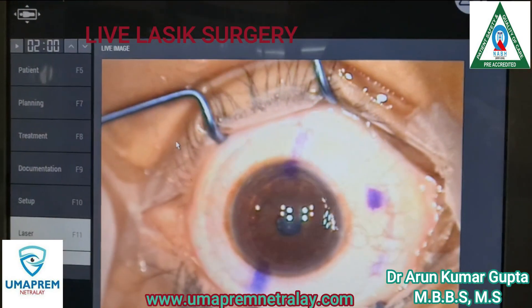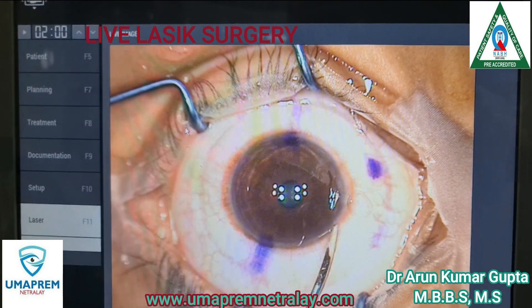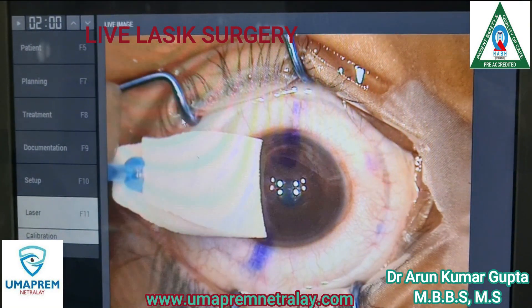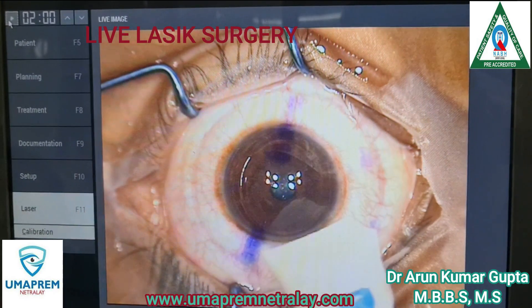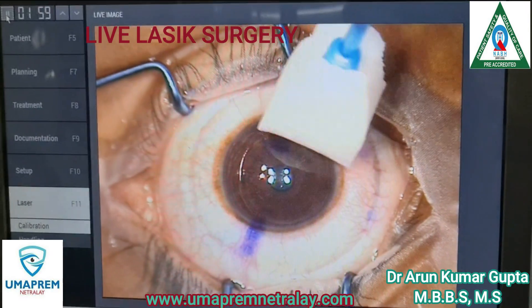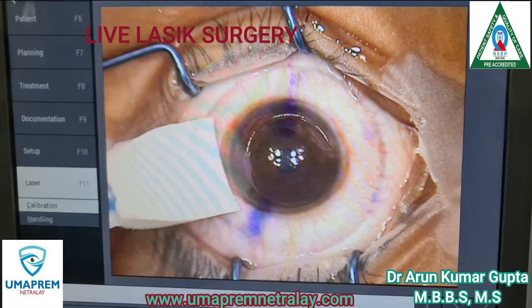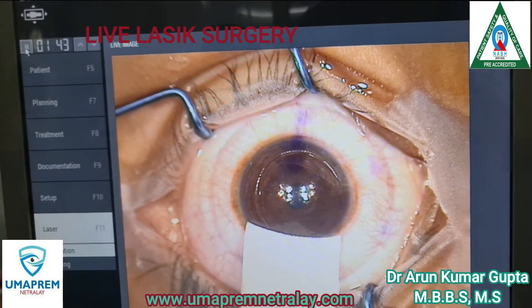We wash the corneal bed with BSS. Again, we reposition the flap. The edge of the flap is dried with merocel sponges in all directions. We normally wait 1-2 minutes for drying the edge.